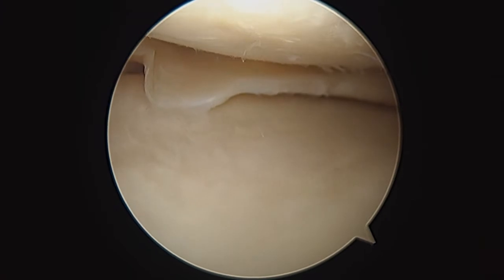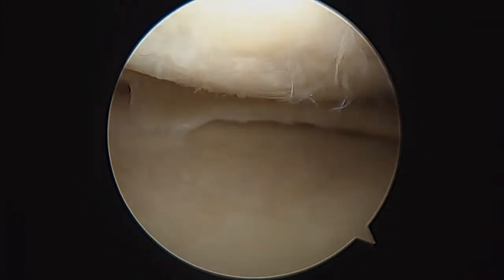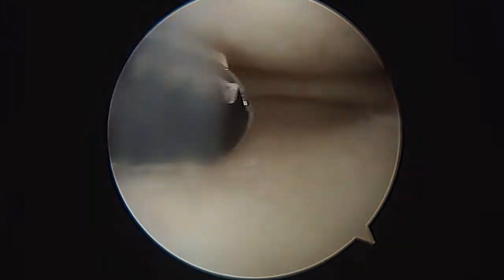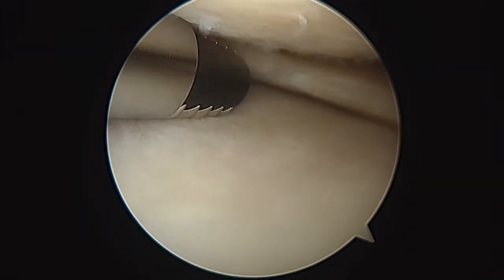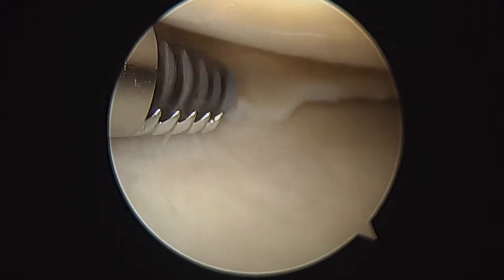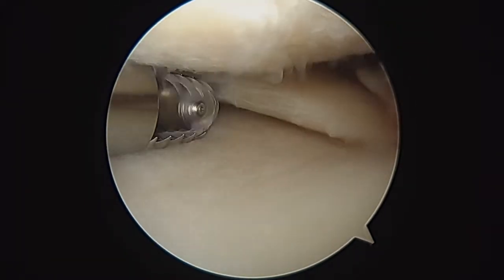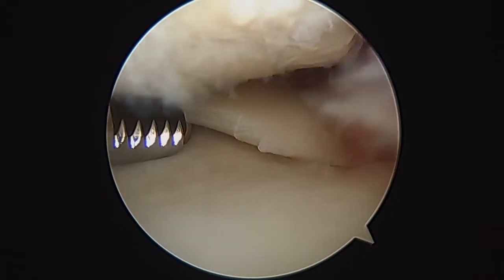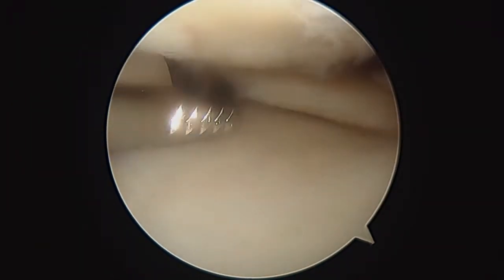That's probably all we have to do. That's why I think that's a better option for you — to get you back on the court doing everything you want to do with minimal downtime. Now we've just got our shaver going with suction again. You can see how now that little torn flap is gone.